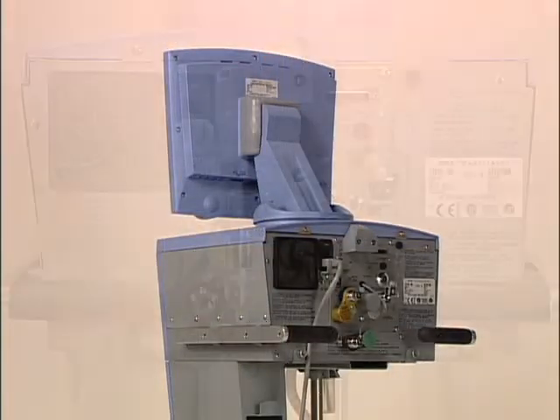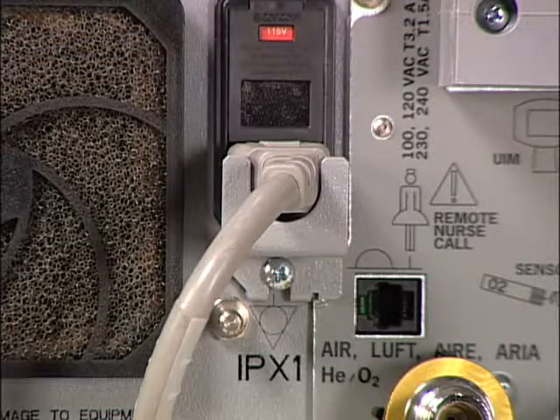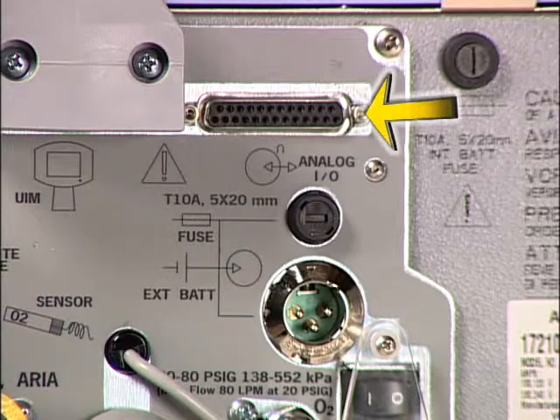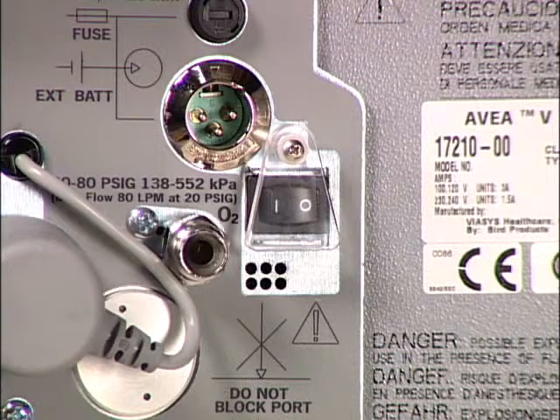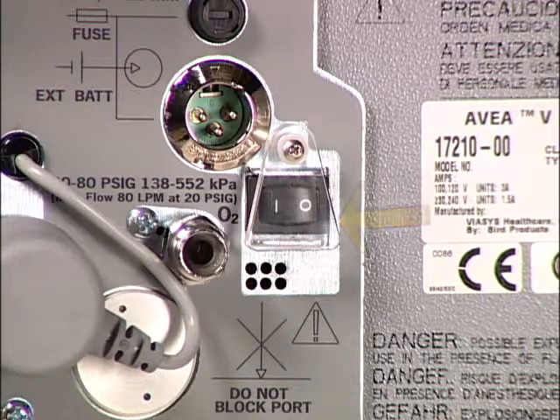All of the electrical and pneumatic connections for AVEA can be found on the rear panel of the ventilator body. The power cord is protected from accidental disconnection by nestling the connector in a strain relief compartment. Moving clockwise from the power cord, an analog input-output allows recorders and monitors to interface with AVEA. The independent lung ventilation cable is also connected here. Below the analog input-output, we find the fuse and connector for the external battery. The on-off switch is found below the external battery connector and is protected from inadvertent actions by the protective cover.